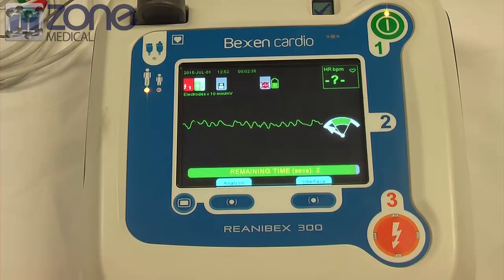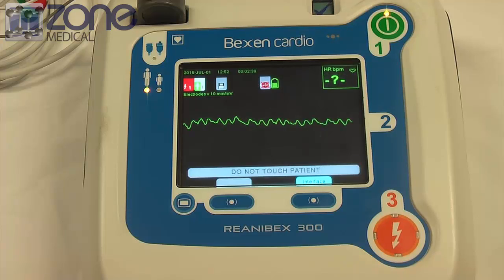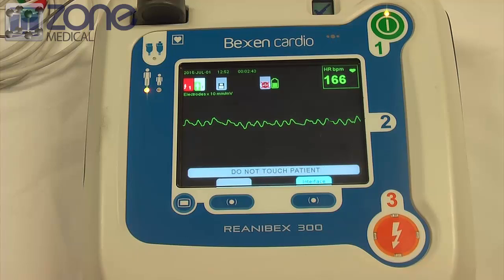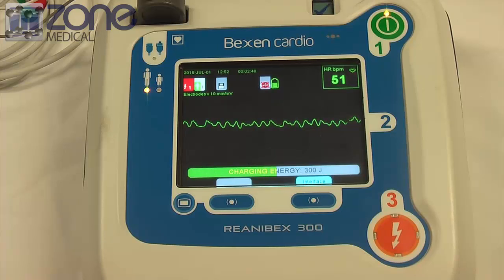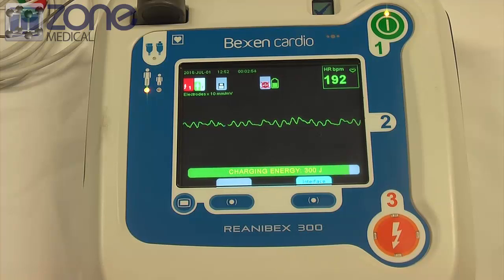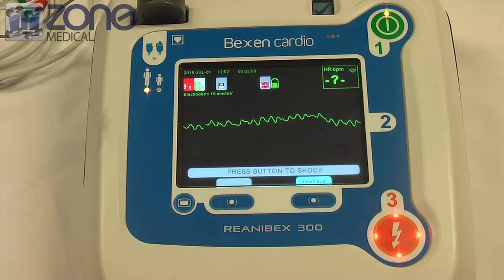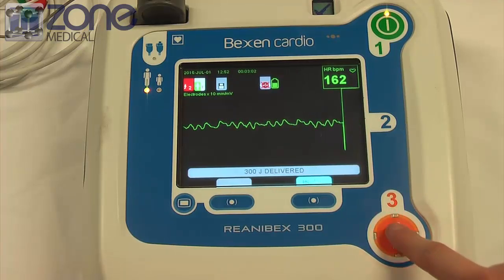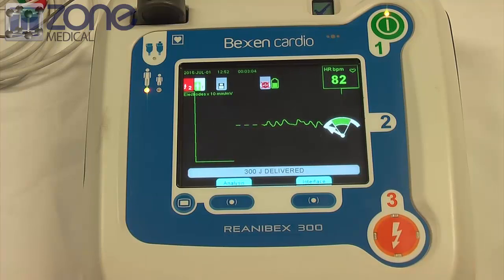Keep time with the beat. Do not touch patient. Analyzing heart rhythm. Shock advised. Do not touch patient. Press flashing button to deliver shock. Begin cardiopulmonary resuscitation.